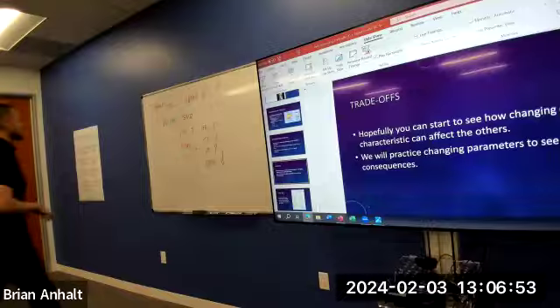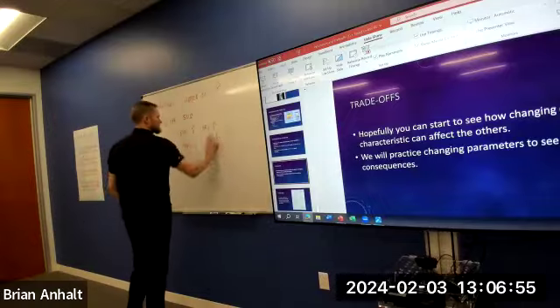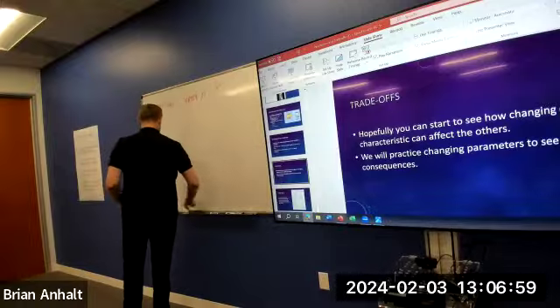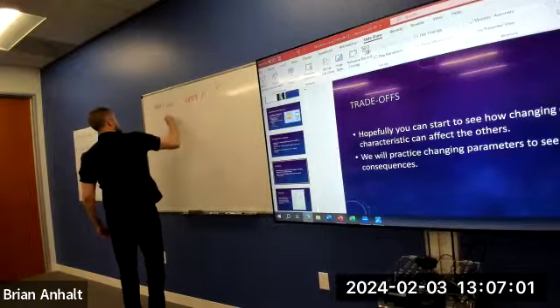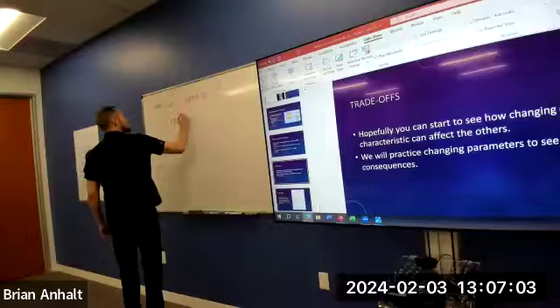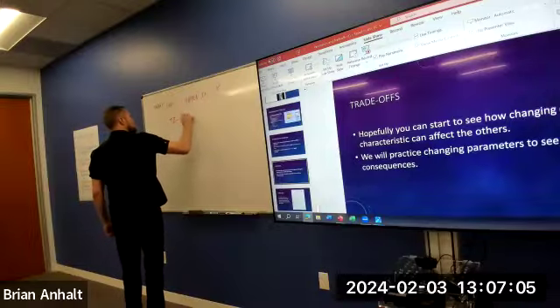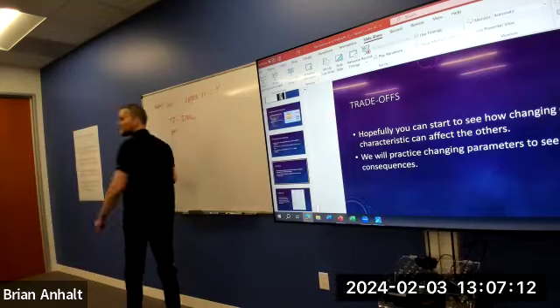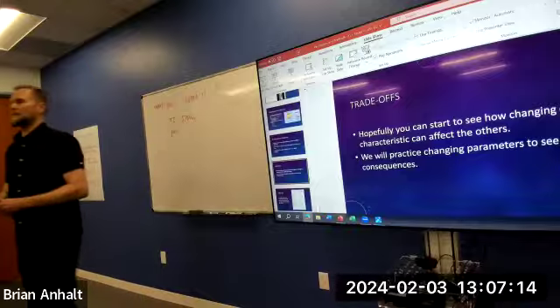Let's do it right now. What's my TR? TR 3700. 3,700 milliseconds. What is my phase matrix? It gives you a matrix, right?